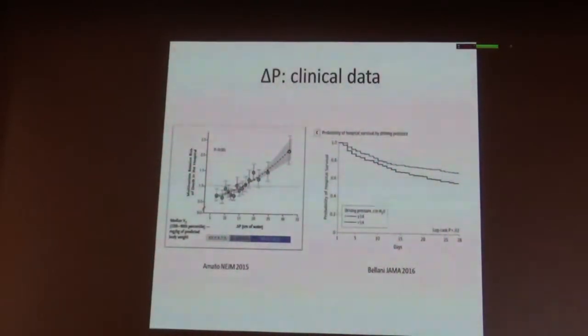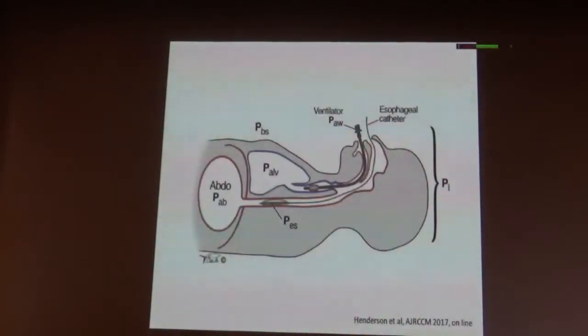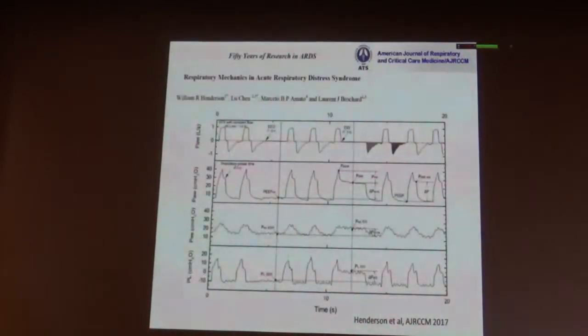The measurement of respiratory mechanics, which we described recently, benefits from the use of the esophageal pressure, which can tell you the real distending pressure of the lung and the pressure inside the chest. These measurements can all be done at the bedside with really minimal equipment.